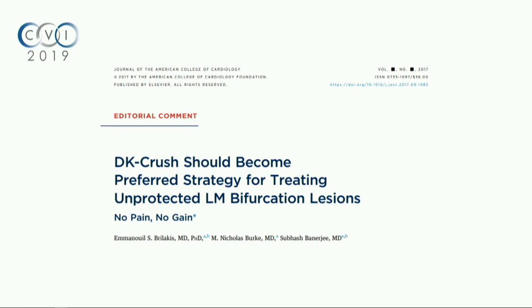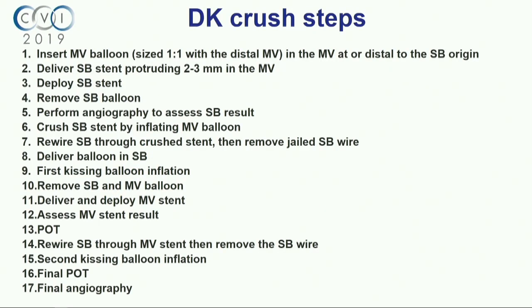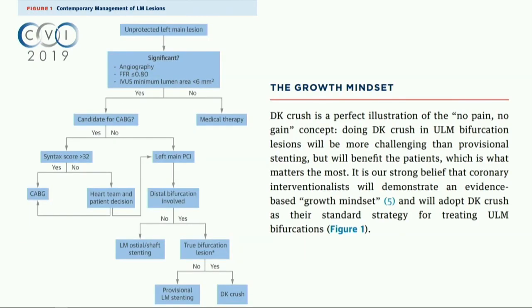This was the editorial for the DK Crush 5, and the title was that DK Crush is the preferred, and there's no pain, no gain. Because there's no question that DK Crush is complex. And this is my latest. I'm updating this every once in a while, and I'm now up to 17 steps. I'm going to break down step by step. So it was 10, 11, now it's 17. So yes, it's a little complex, no question about it.